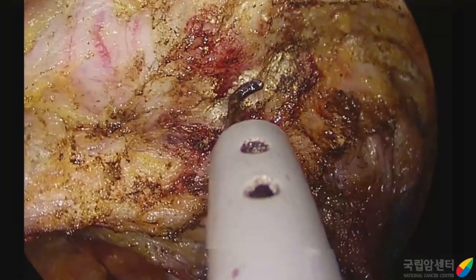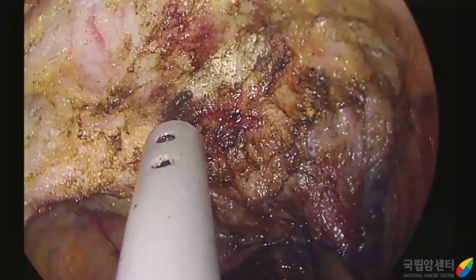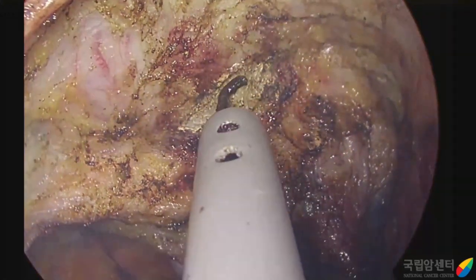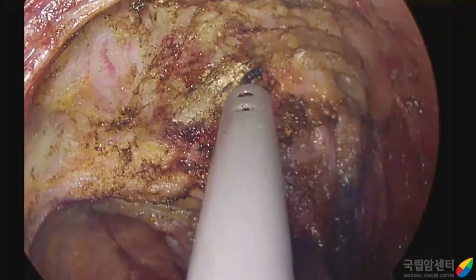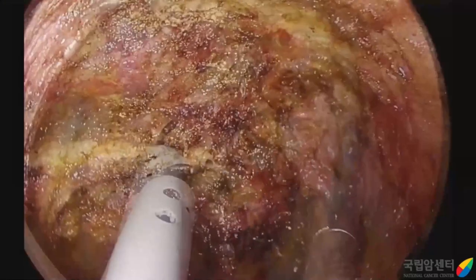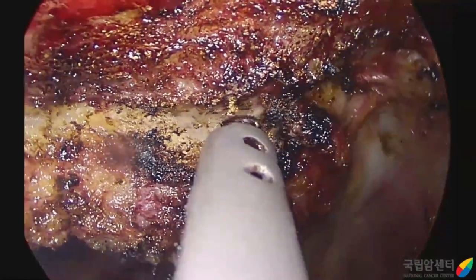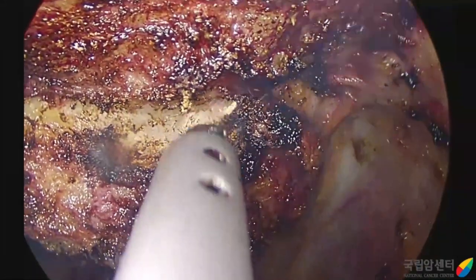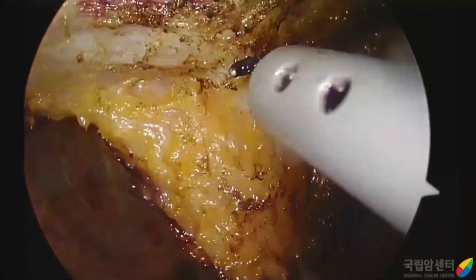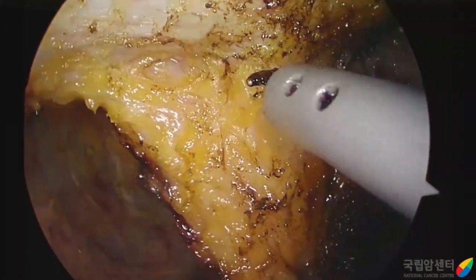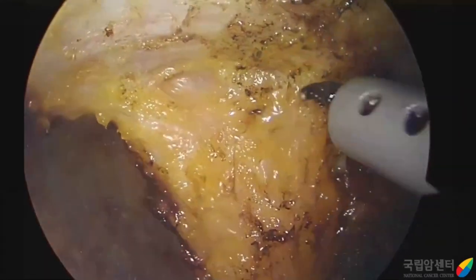The tumor of this patient was located anteriorly and closely abutting to the prostate. So we needed very slow and careful dissection, checking the circumferential resection margin. After surgery, the pathological examination showed ypT3N0 stage with clear circumferential resection margin.